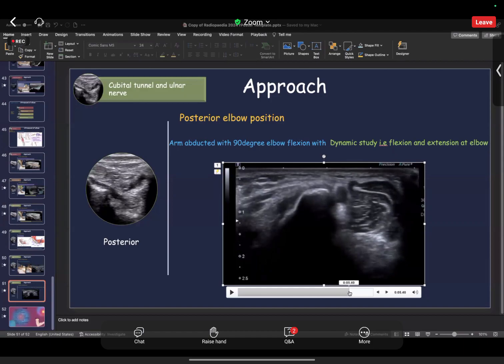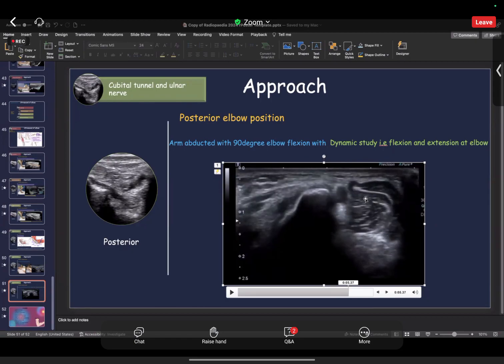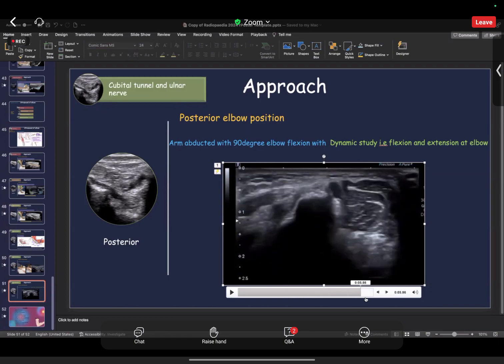You see, someone is pushing. So what happens during flexion? There is a small space in the posterior medial compartment, and during flexion it is getting shorter. So the triceps is pushing your ulnar nerve over the medial epicondyle, and you may hear two snaps, of the ulnar nerve and the triceps. So basically, this is snapping triceps syndrome with ulnar nerve subluxation.